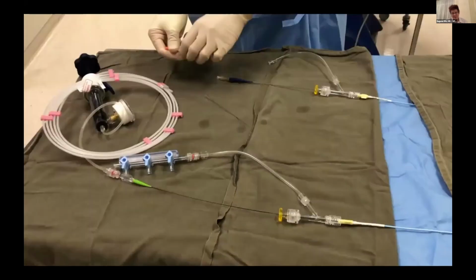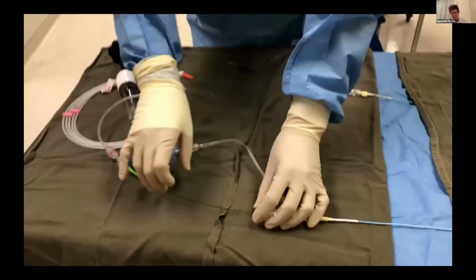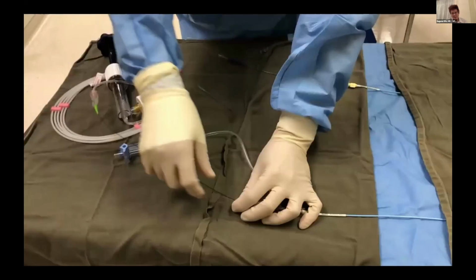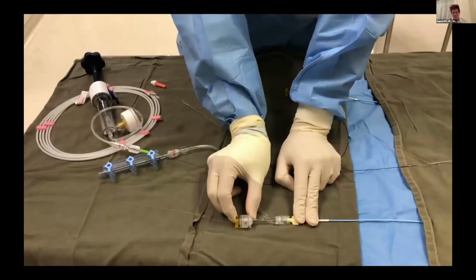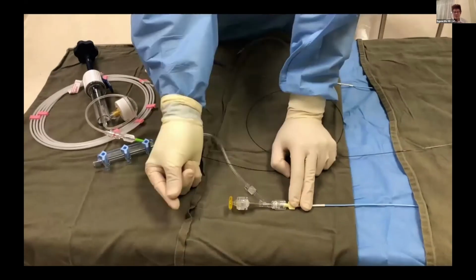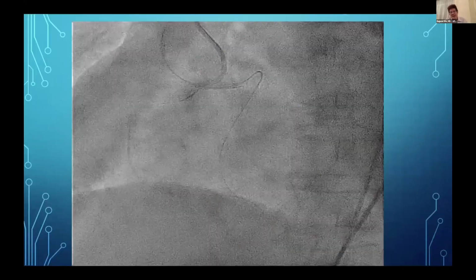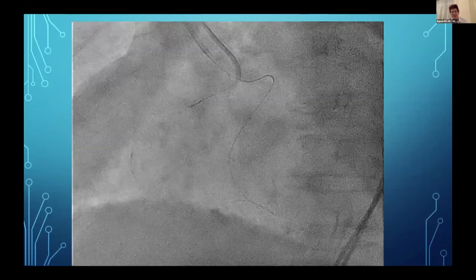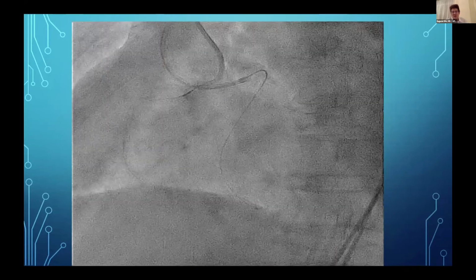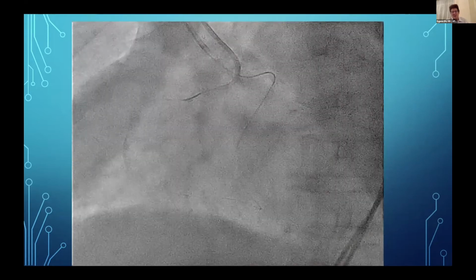And then we're set up now. If we deflate the anchoring balloon and remove the anchor balloon, we allow bleed back to make sure that there's no air trapped. And now we have access through this wire to the antegrade side. So it's important, I showed this video, it's important to pull back the retrograde guiding before we back out the retrograde microcatheter. Otherwise, you have a danger of sucking in the retrograde guiding and damaging the left main. So I put this video in just for that. And so after you externalize, you can then balloon and IVUS and stent.